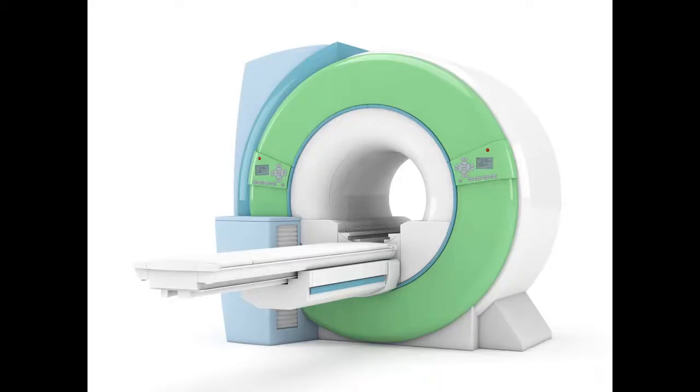CMR is an imaging modality that has developed greatly over the last 20 years and now offers an unrivaled way of assessing cardiac structure and function. Although there are of course other non-invasive imaging techniques such as echocardiography and nuclear imaging that can offer similar information to some aspects of CMR, CMR offers the huge advantage of combining the best aspects of these studies into a single examination. Moreover, CMR offers some significant advantages over these other imaging techniques.